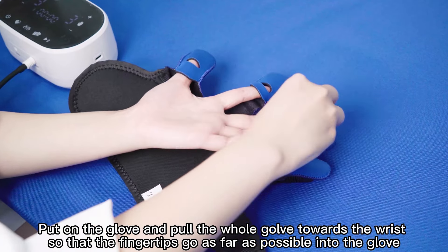During the training, the affected hand follows the movement of the healthy hand and performs extension or flexion simultaneously. If both hands are unable to extend or flex on their own, it is recommended to start with passive training.